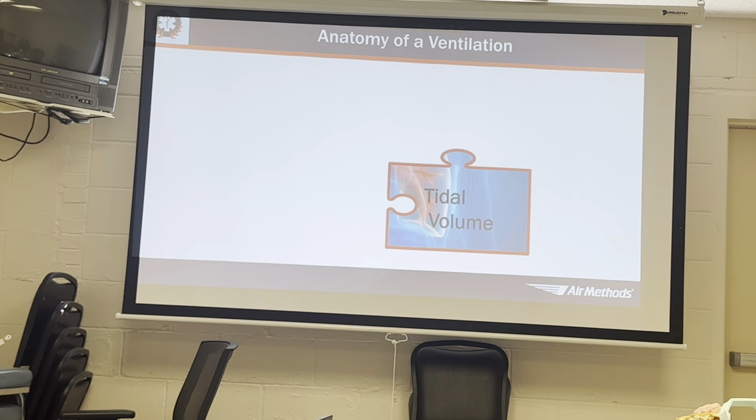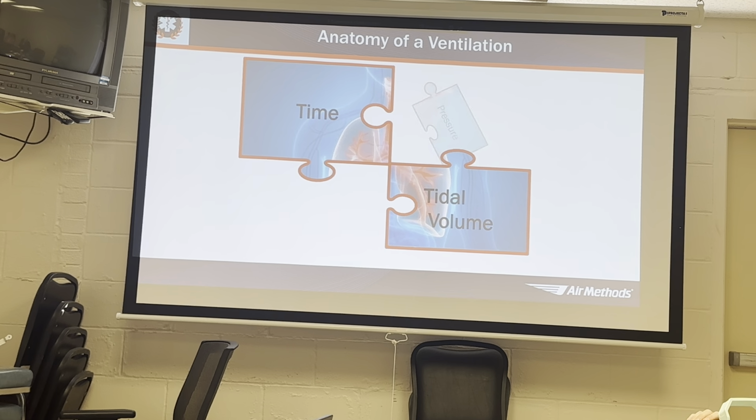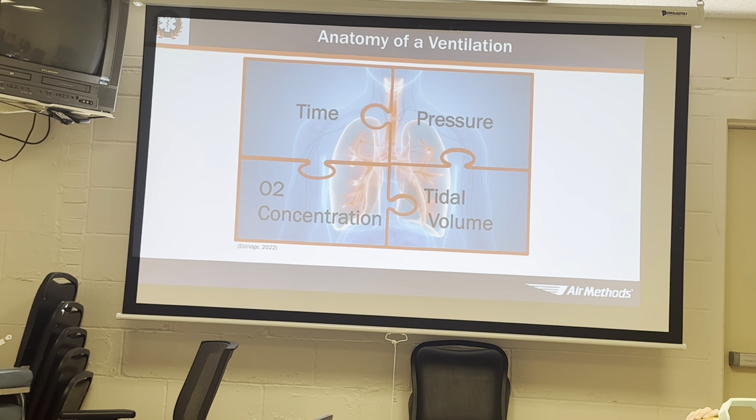So this is where it starts. We're going to talk about actual ventilatory concepts, and I'll just pull all of these up. So tidal volume. Tidal volume is just a fancy way of saying how much air are we breathing in. Pressure. There is a pressure that we need when we're positively ventilating somebody. There's a pressure that we need to overcome to fill the lungs with that volume. The O2 concentration, FiO2.